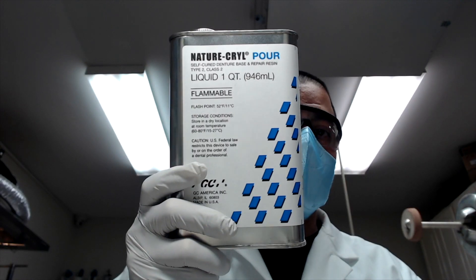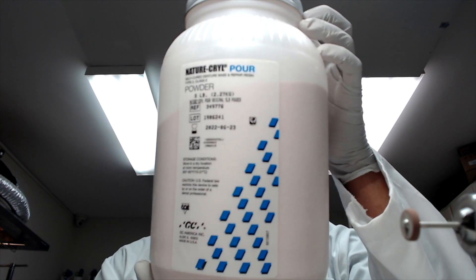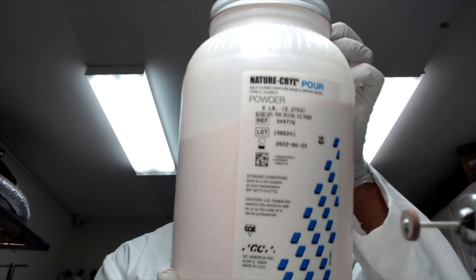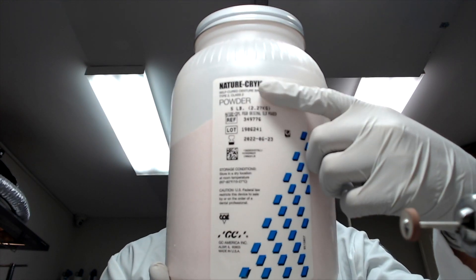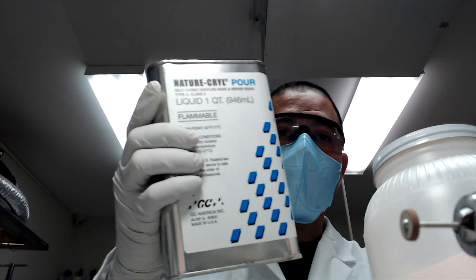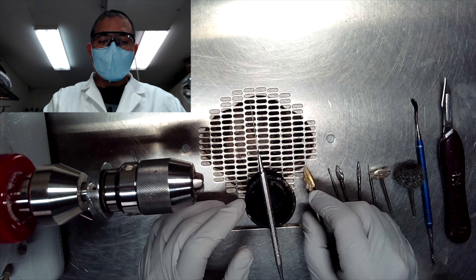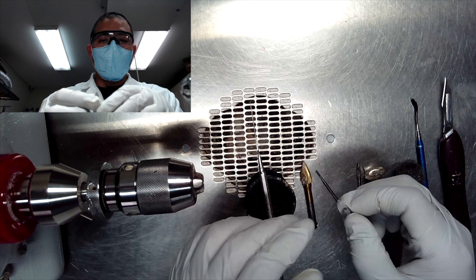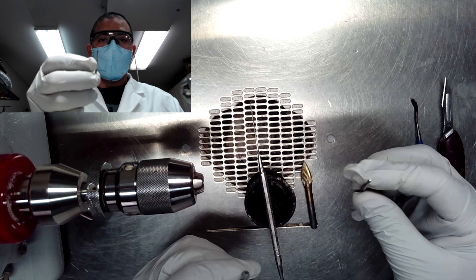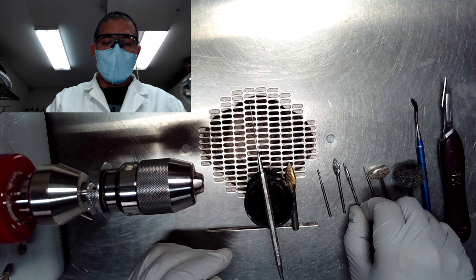Next, gather the materials and equipment you may need to perform the repair. The number one thing necessary is to have a self-cure or cold-cure acrylic resin in the form of polymer powder and monomer liquid. These acrylics do not need to be in a controlled heated environment in order to cure, and they cure a lot faster than heat-cure acrylics. Next, be sure to have the proper burr set, whether you're going to be using a lathe or a handpiece, depending on the kind of burrs you want to use.